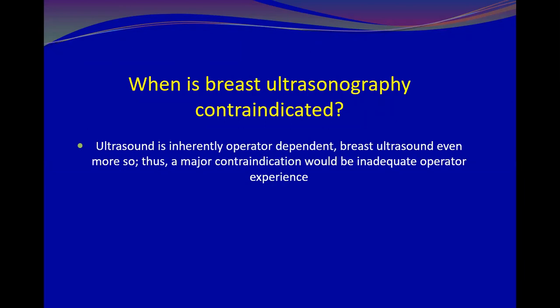Ultrasound is inherently operator dependent, and breast ultrasound even more so. Thus, a major contraindication would be inadequate operator experience. This is a contraindication; now, indications for breast ultrasound.